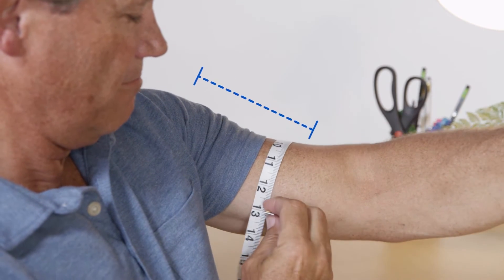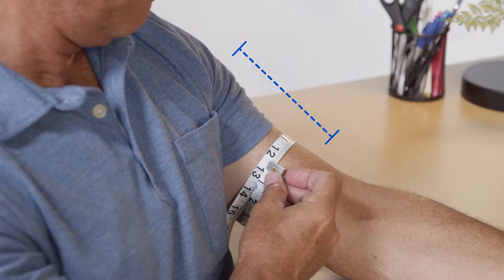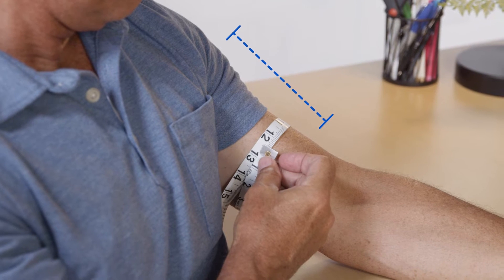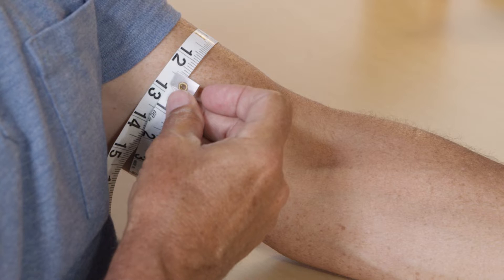Wrap a soft tape measure around your arm at bicep level, or halfway between the elbow and shoulder. The measuring tape should be snug, not tight. Record the measurement to determine your proper cuff size.